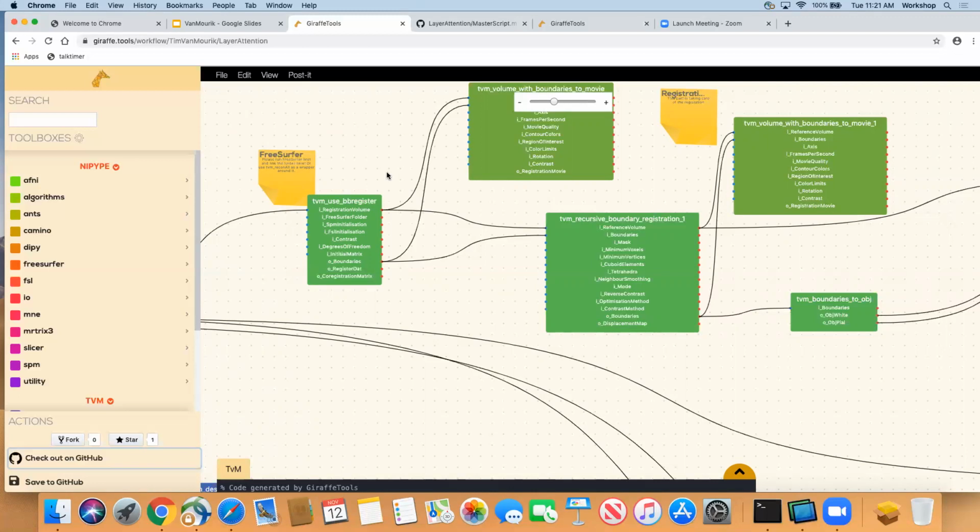Has anybody ever done any layer analysis before and done this cortical layer? And has anybody done co-registration before? So the way we tackle this problem in Nijmegen at my lab was a very naive way. I've heard several people like Renzo and Cheryl doing fancy things on the scanner and making sure that there is anatomical contrast in the EPI, which is your take-home message, I believe. What we did was a boundary-based registration. Does that ring a bell to people?